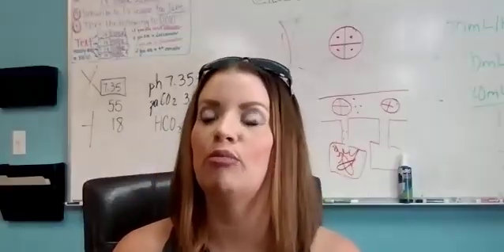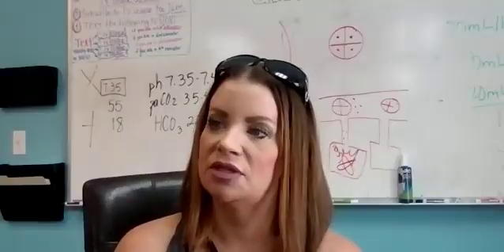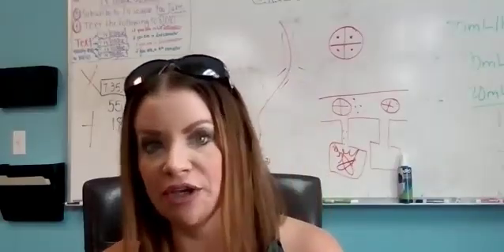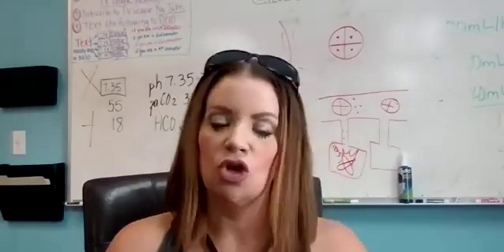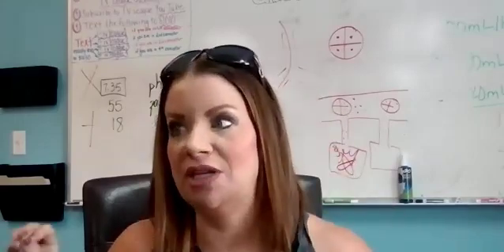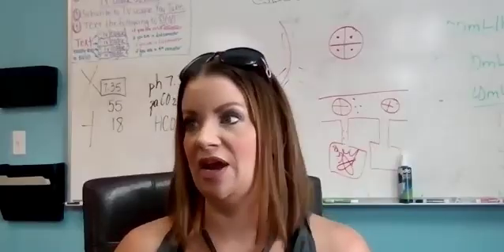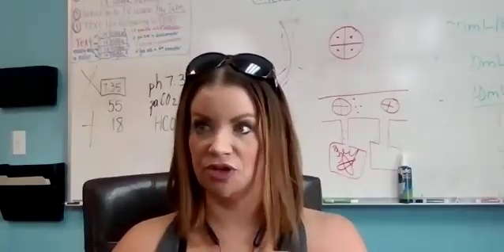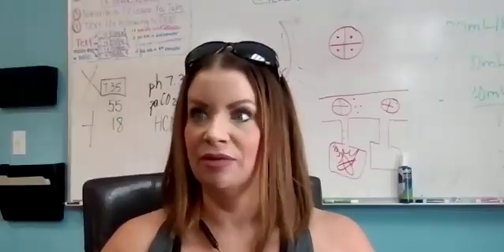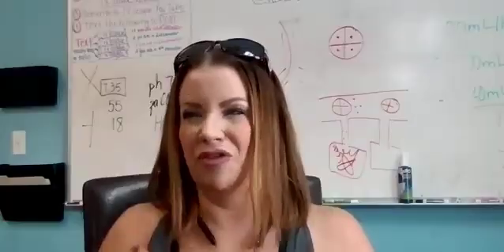So if you needed more pressure, what are you going to use? CPAP or BiPAP. If you need more volume, Vapotherm. Do you understand the difference? Okay. So who needs volume? Who actually needs air and oxygen? Those are people whose chest will not expand right. Those are patients that have had chest surgery or abdominal surgery. They won't breathe deep because they're stitched or sutured together and very restricted.